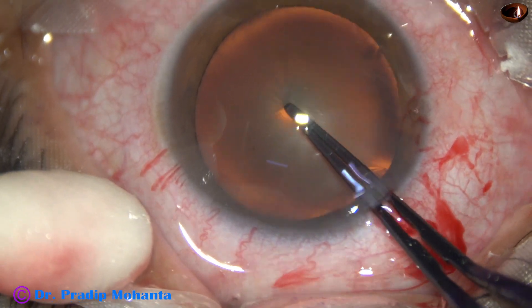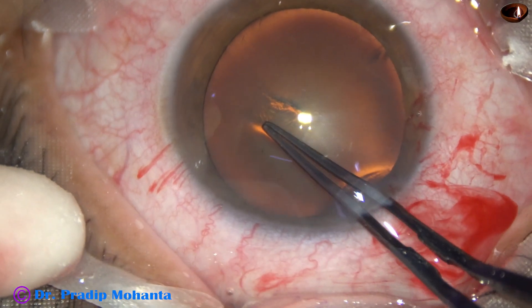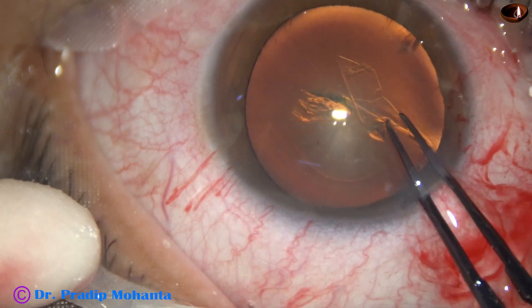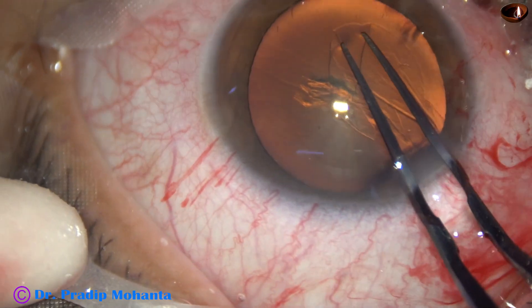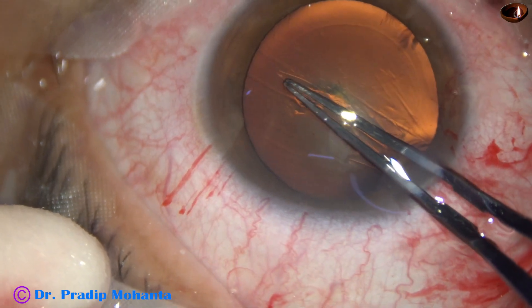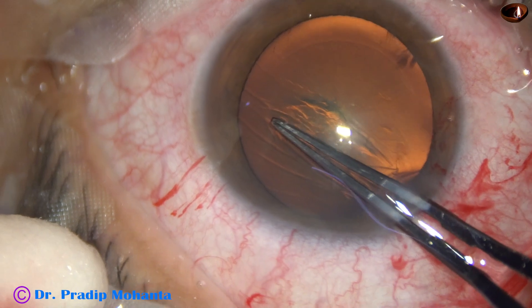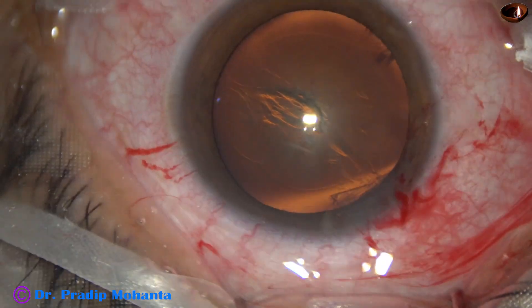Capsulorhexis is done with the help of Utrata forceps. The rhexis tends to go to the periphery. With a joystick pole, it is brought back on track.